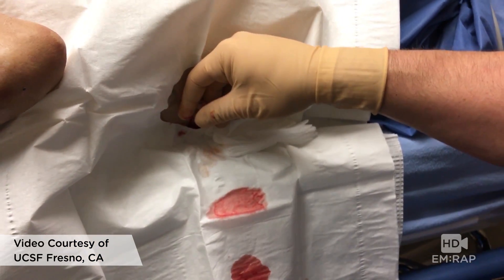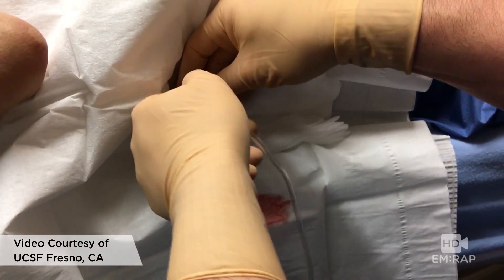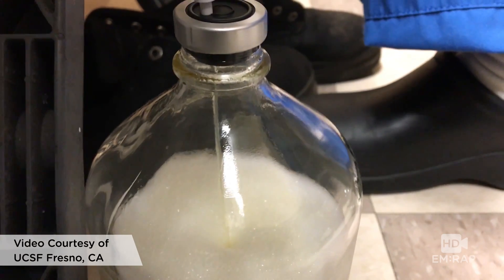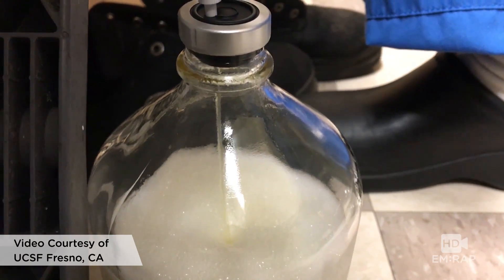Connect your tubing to the catheter and to the vacuum-sealed containers, which notably are not sterile. So at this point you are no longer sterile, unless you have an assistant to help you with this.